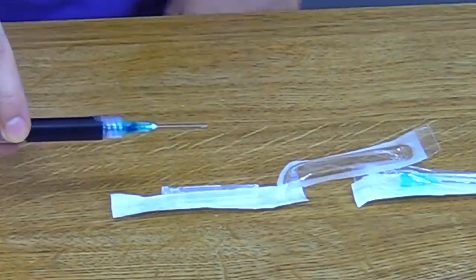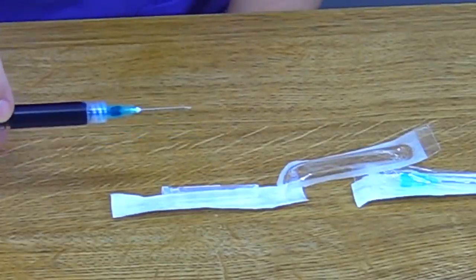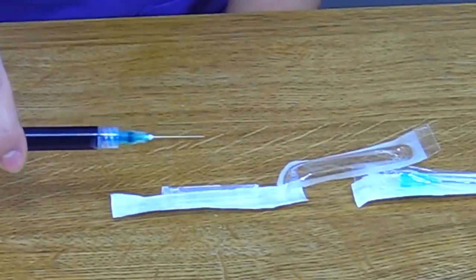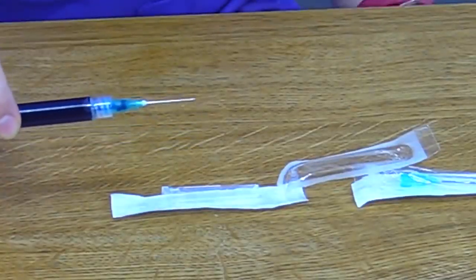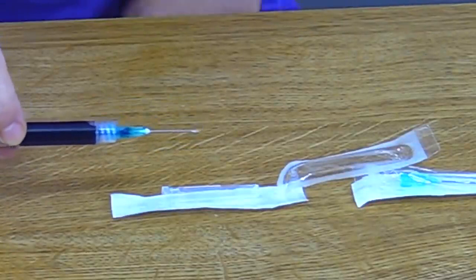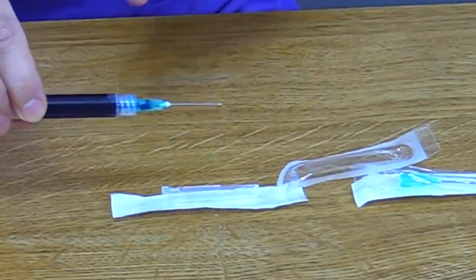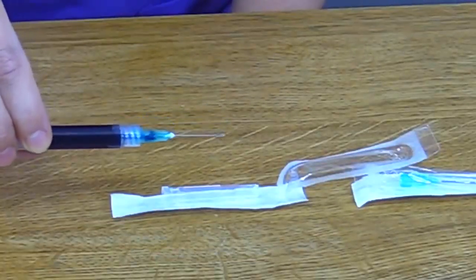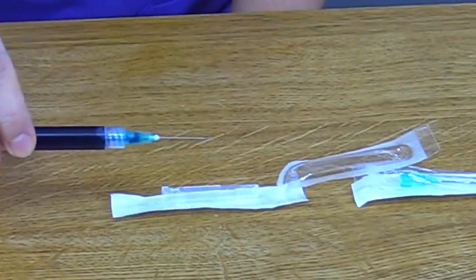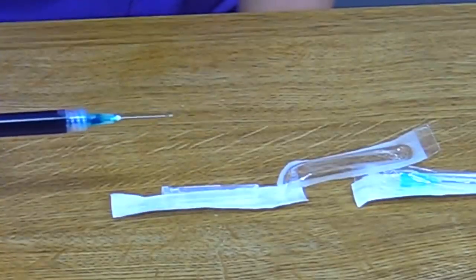Well, there's 2 reasons. One reason is whenever we penetrated the stopper of that vial, it can dull that needle, and that would not feel very good to the patient to get a dull needle if they're getting an injection, let's say. Also, this needle has been inside the medication vial, so on the needle you can have some residue of the medication, and if we just inject that into our patient, it can get into the surrounding tissues and cause issues. So those are just some of the reasons we want to do that.